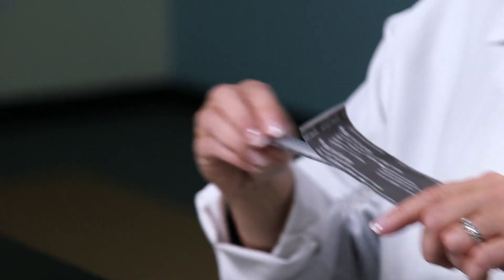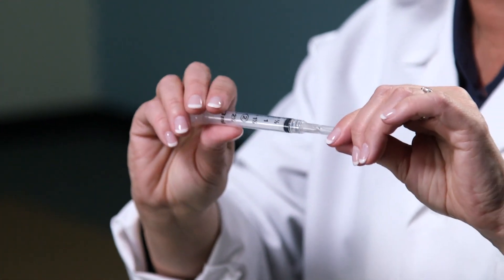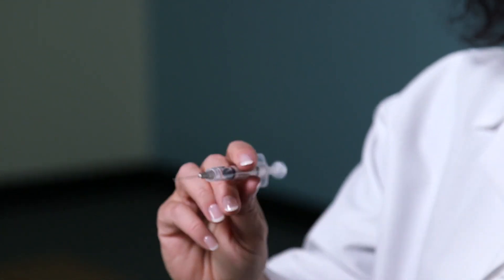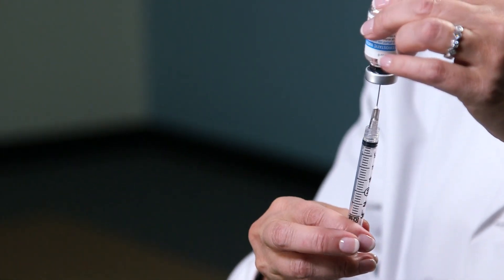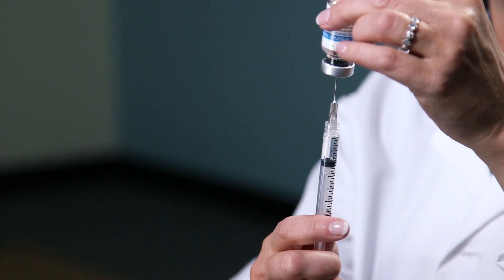Using a 3ml syringe with generally a 22 gauge, 1½ inch needle, pull back the plunger to the prescribed amount, usually 1ml. Place the needle through the center of the rubber stopper, inject the air, and then pull back the plunger to the 1ml mark, or the prescribed amount.